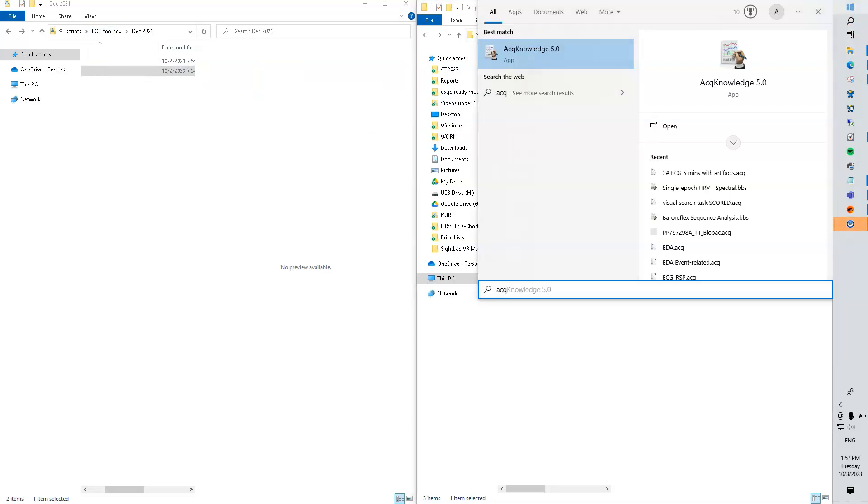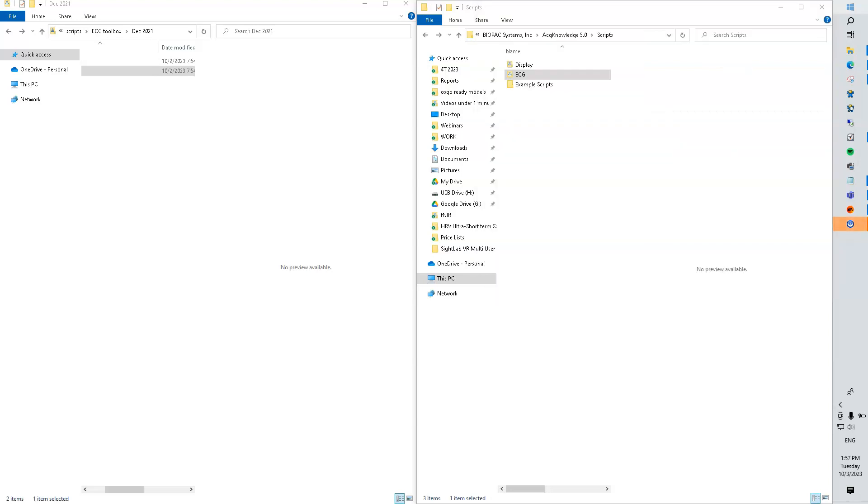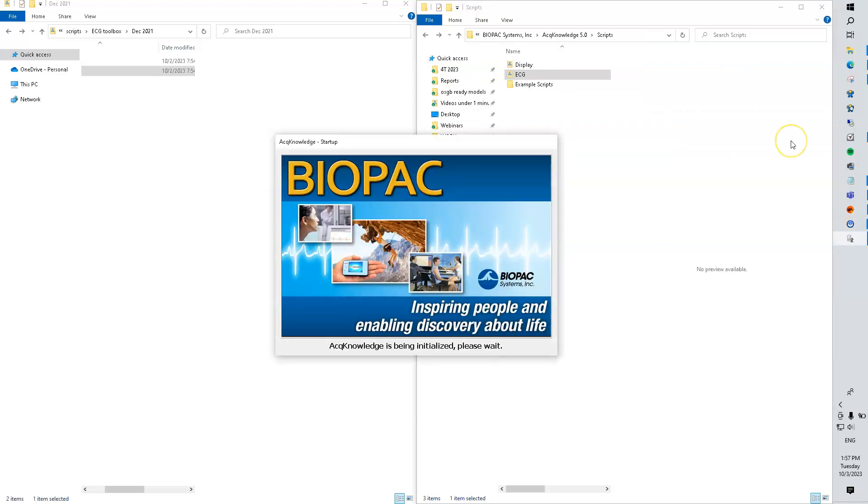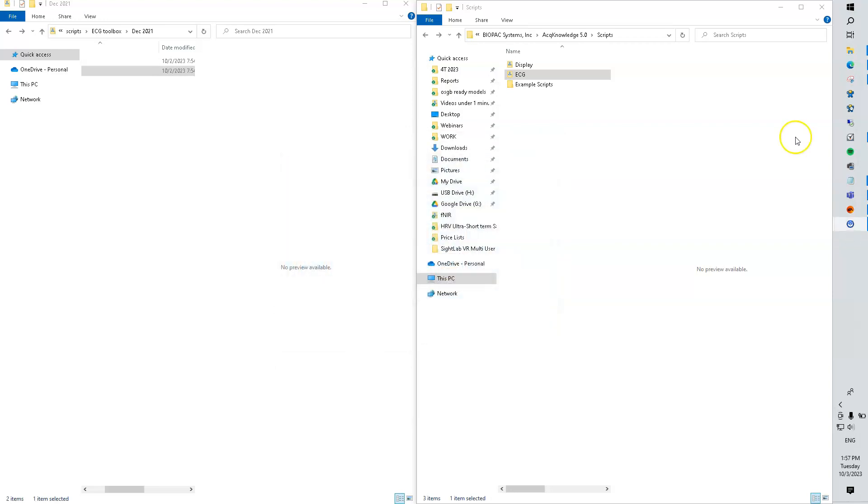Now we'll fire up Acknowledge. When the application starts, these scripts will be present in the Acknowledge menu.